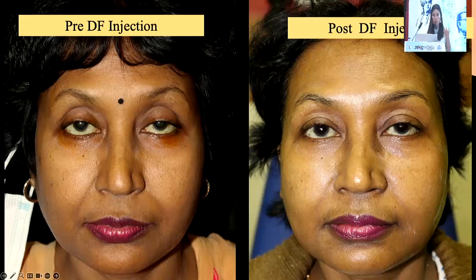If you don't mind, don't take much of these videos and the patient's picture. And you can see so beautiful correction of the superior sulcus.